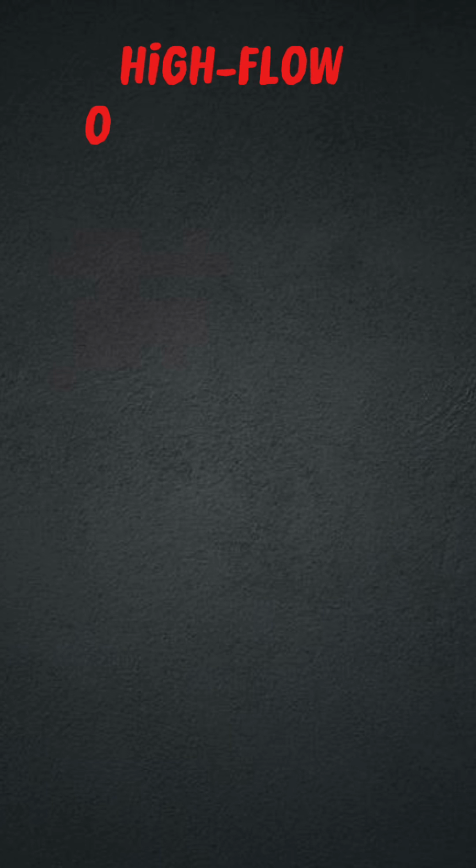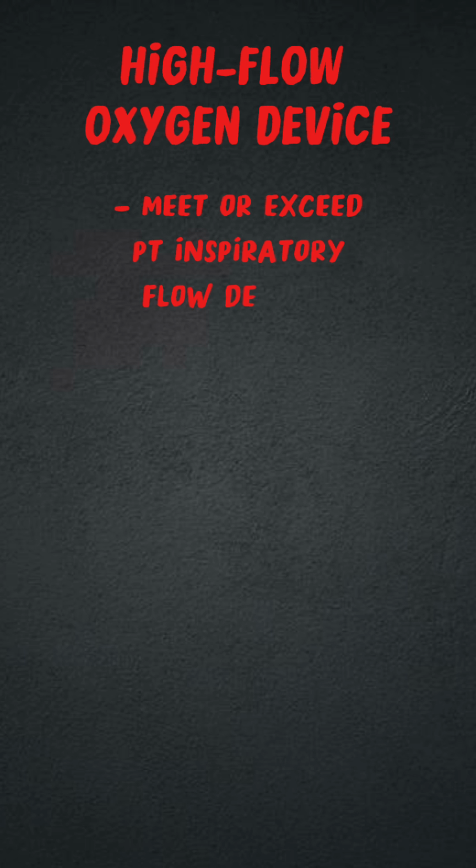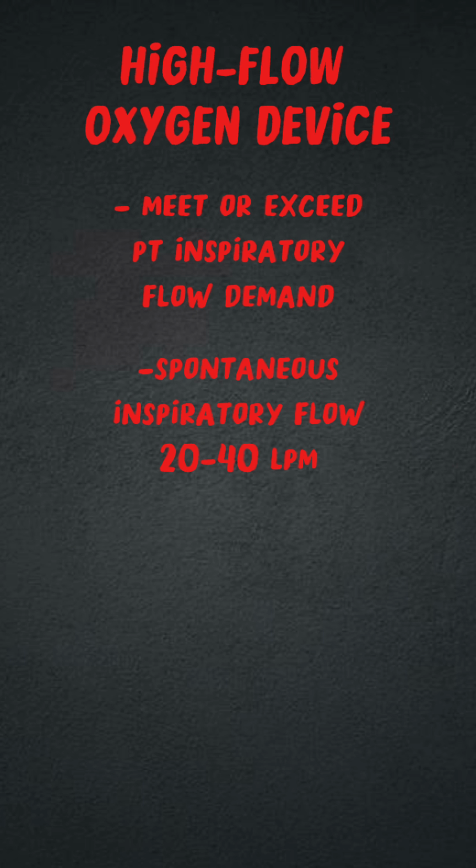High-flow oxygen devices are able to meet or exceed the patient's inspiratory flow demands. Remember that spontaneous inspiratory flow is normally around 20 to 40 liters per minute, but patients in distress will have higher inspiratory flows.